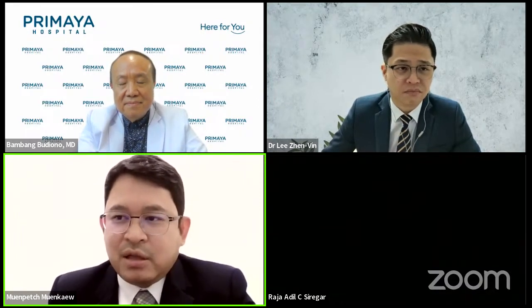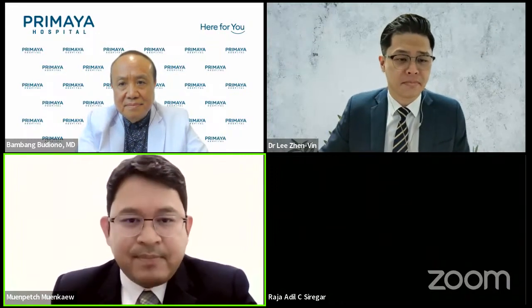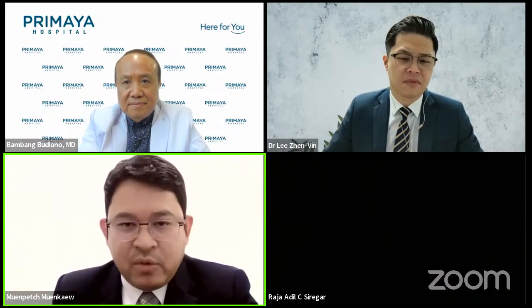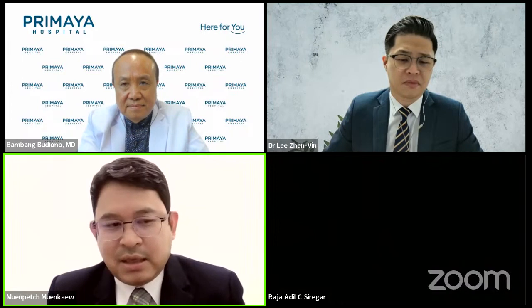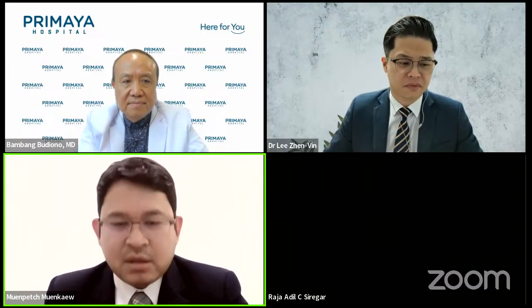And if we have the software to use the CT roadmap, when we change our angiographic view, the CT reconstruction changes to the same view, and this helps very much. Yes, I highly agree. Thank you, Dr. Muenpetch.